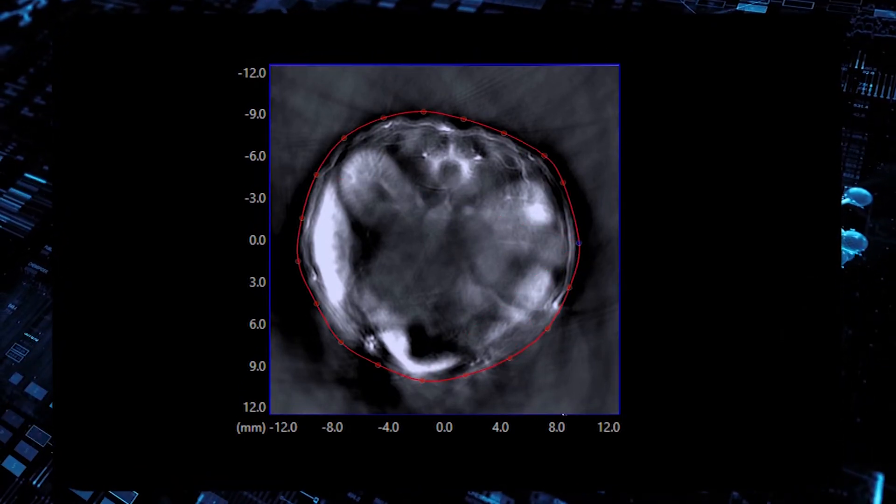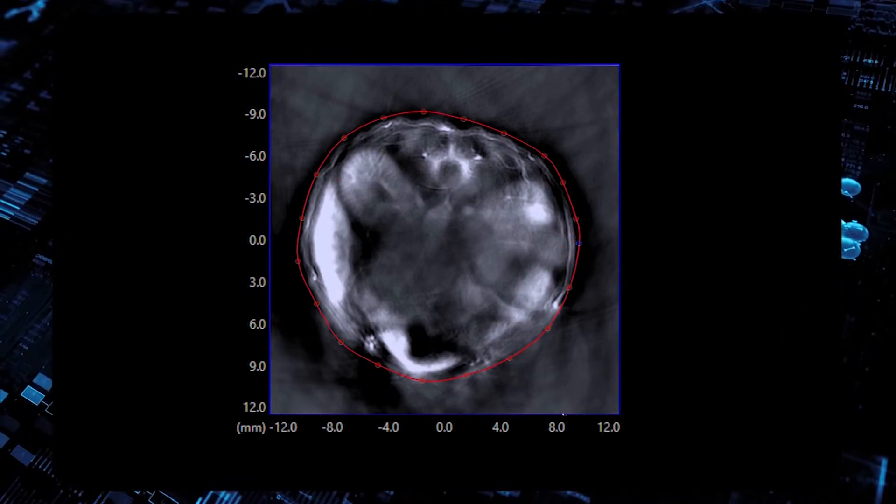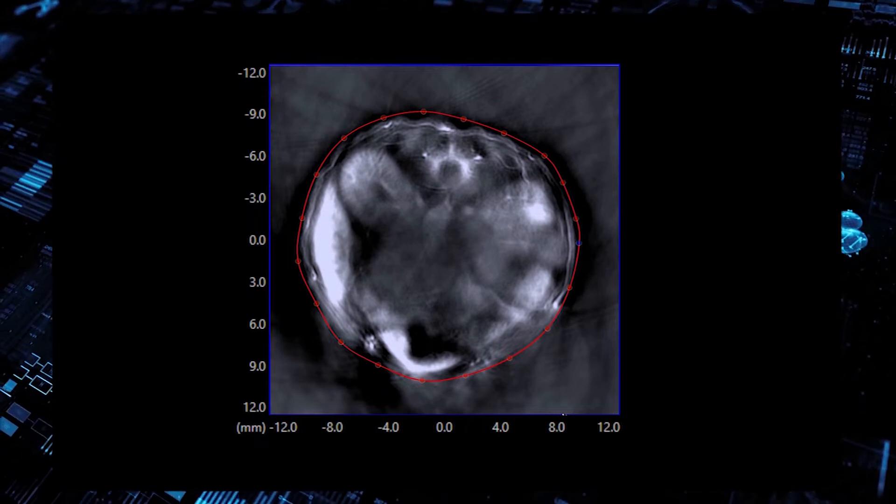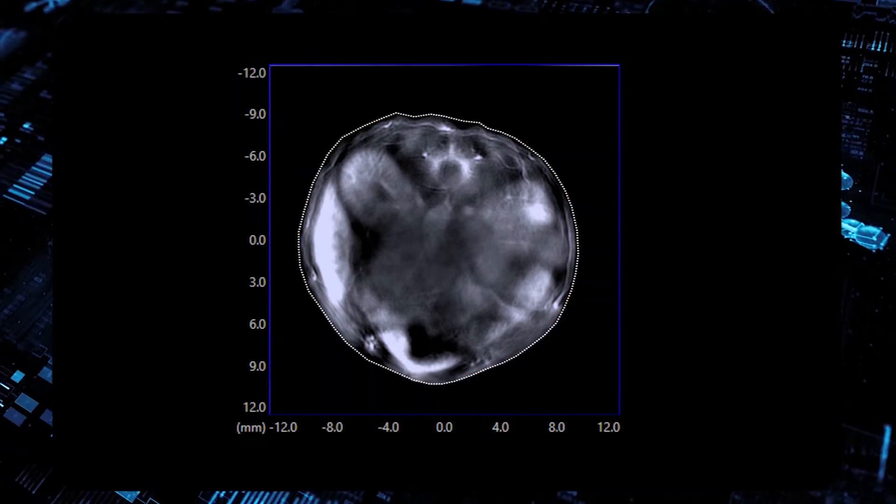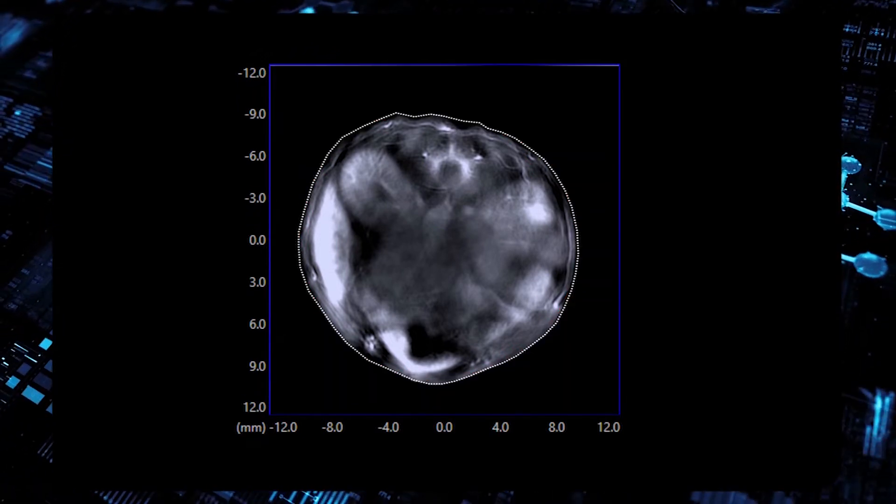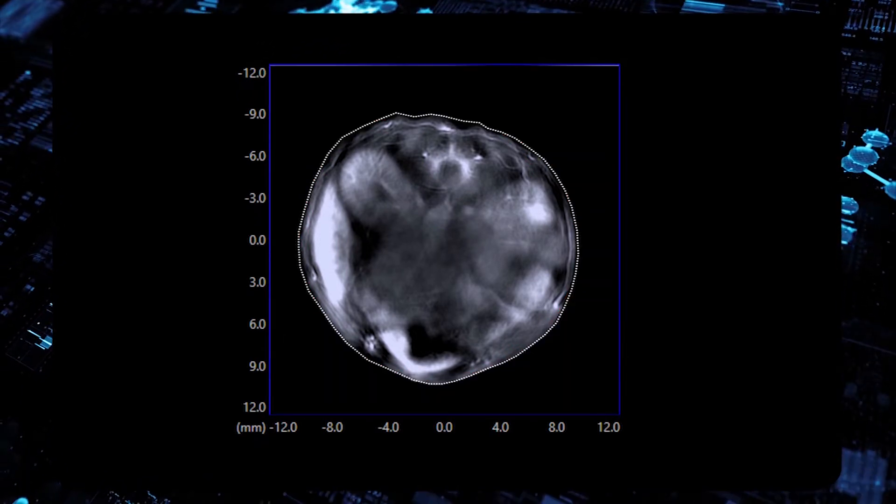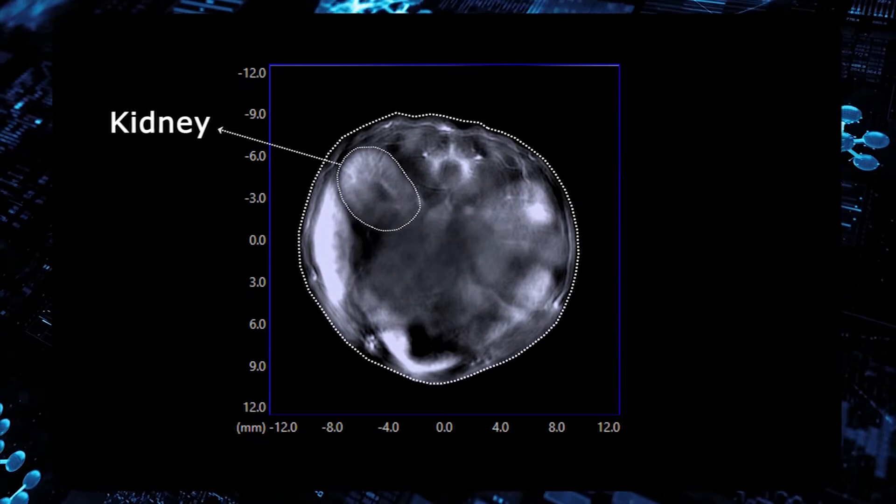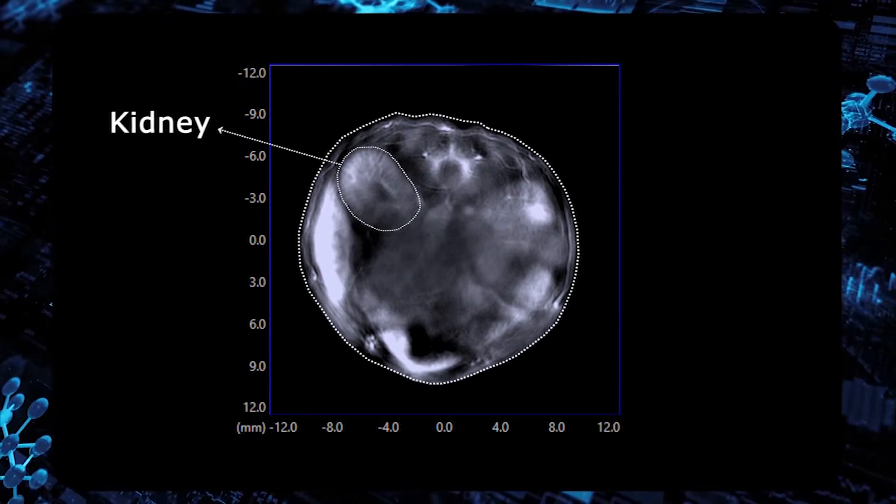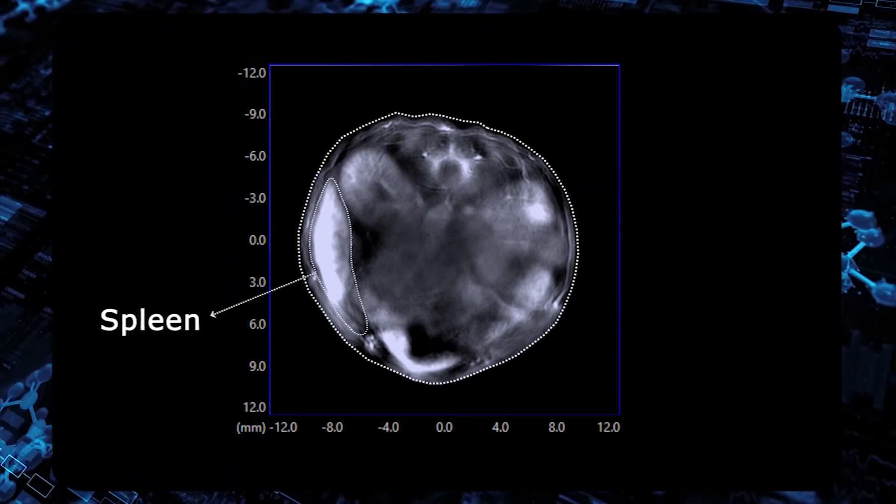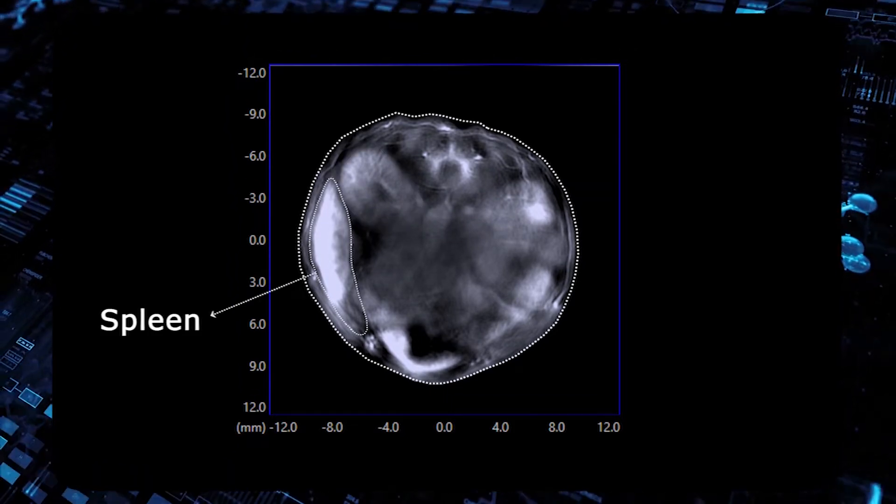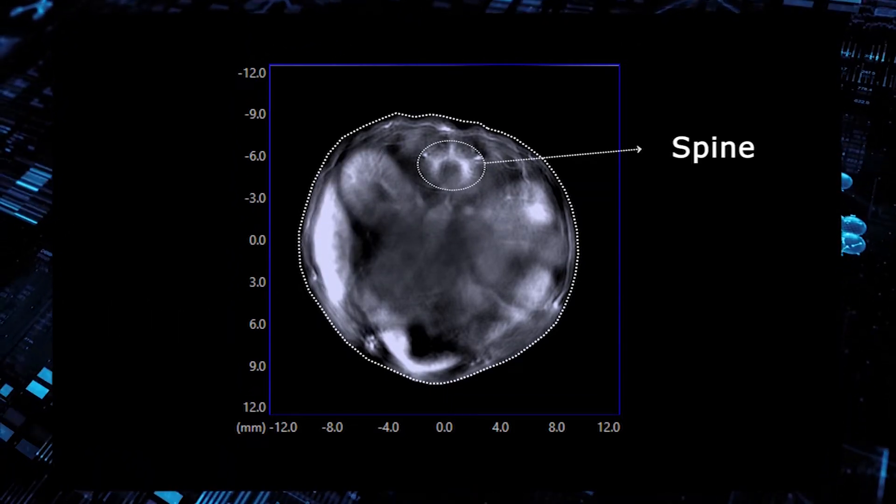In a first step, the boundary of the animal is defined by drawing a contour. Typical structures of interest in a small animal include the kidneys, spleen, and spinal cord.